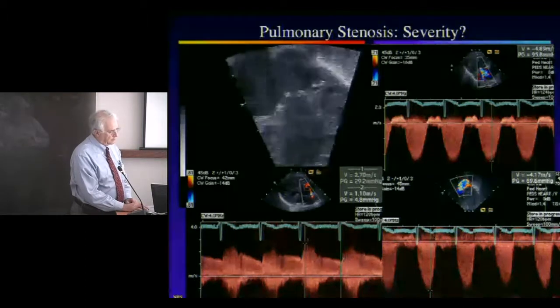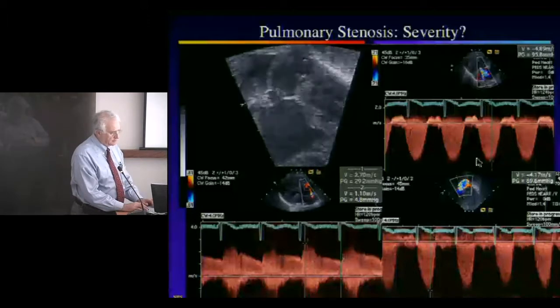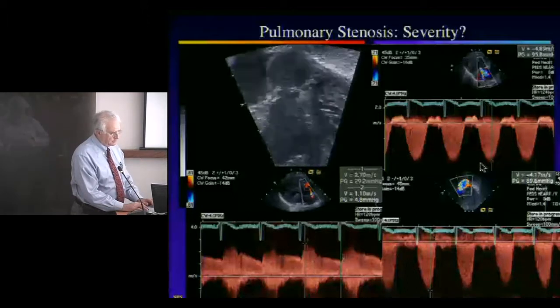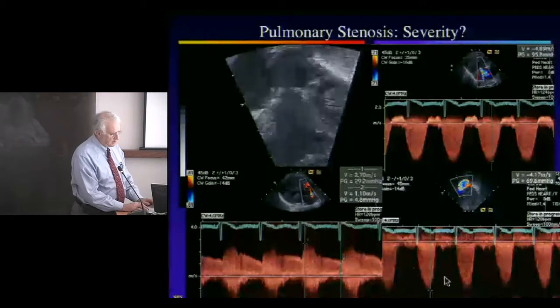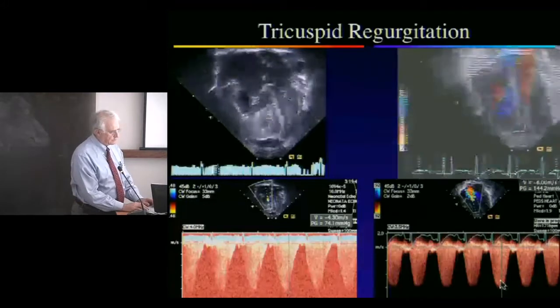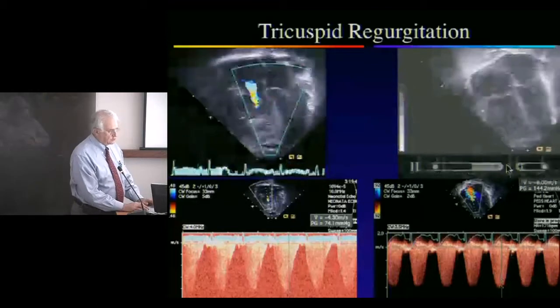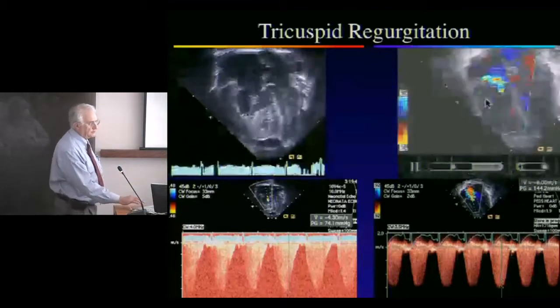Okay, and with the pulmonary artery, I think the best way for evaluating pressure by Doppler is this peak velocity. Again, I think mean velocities provide a more accurate estimation of the true pressure at cardiac catheterization than the peak velocities. Tricuspid regurgitation provides a number of interesting pieces of information.